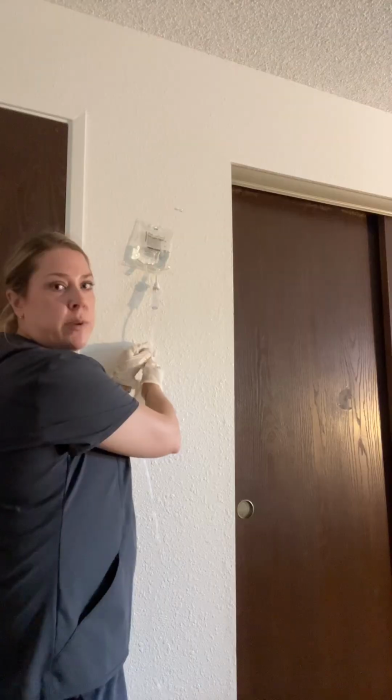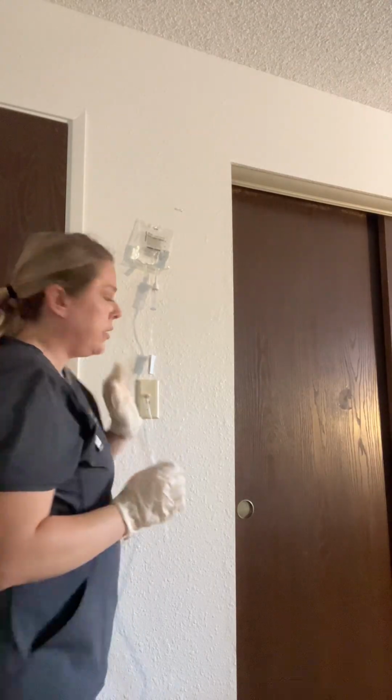Okay, perfect. We got 38. Okay, we're going to close that.